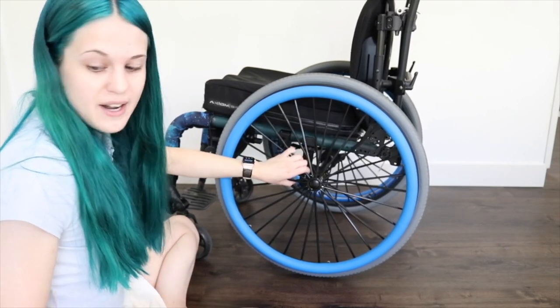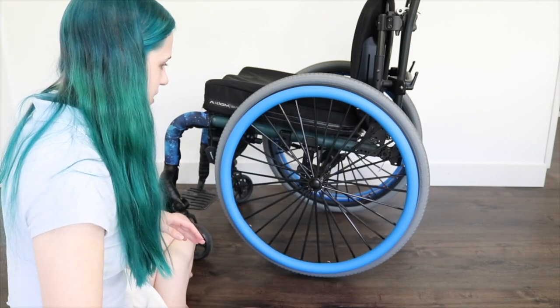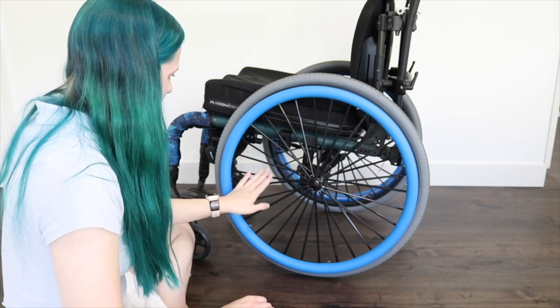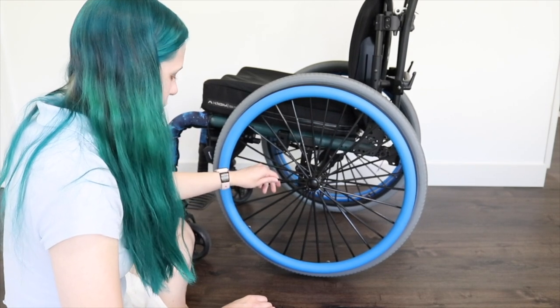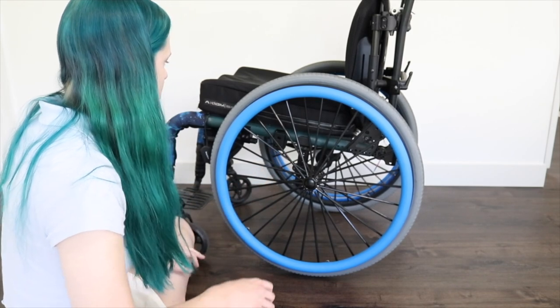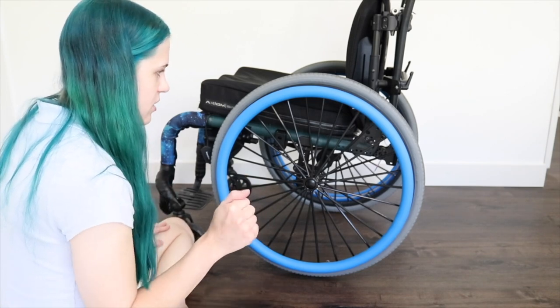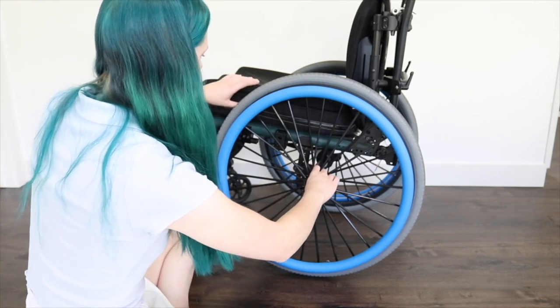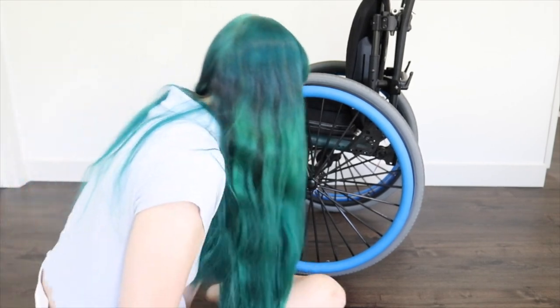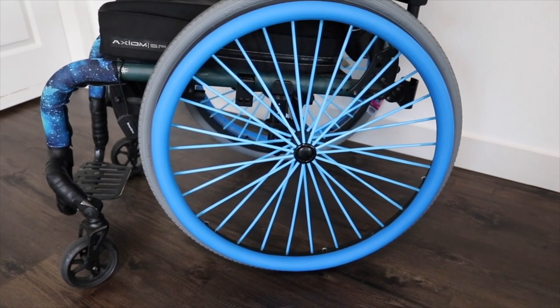Alright, so we have those on. Now I just need to put the spoke covers on, which is going to be a feat because I already have spoke covers on. So I'm going to have to take my current ones off. I could do blue-black-blue-black alternating, but I think I'll just do all blue for now. I'm going to take the wheels off my wheelchair to do this because I think that'll be easier. So this is the finished look of the push rim covers and the spoke covers.